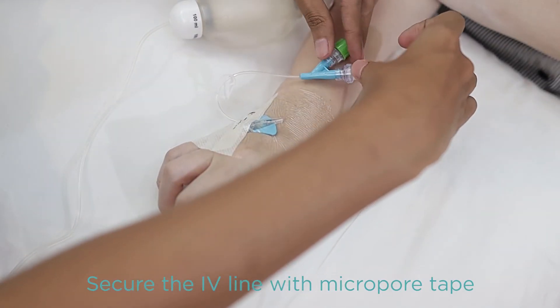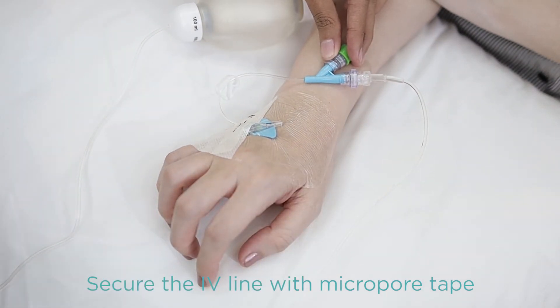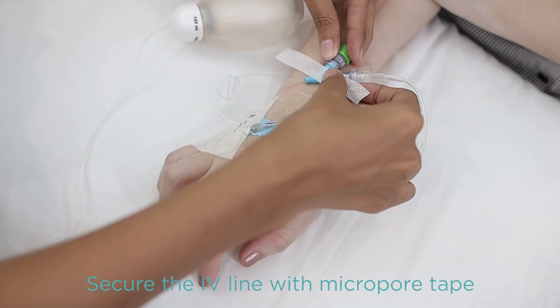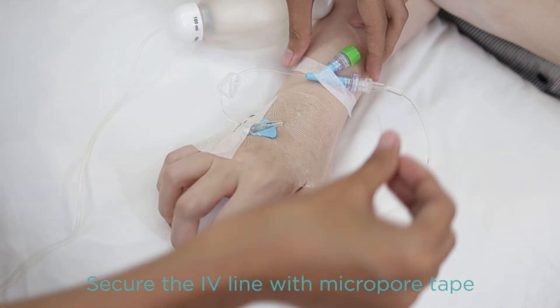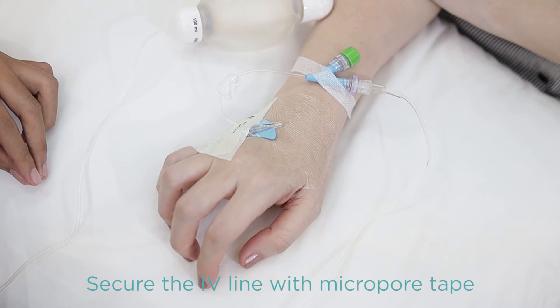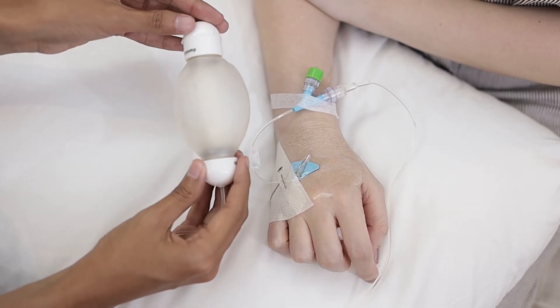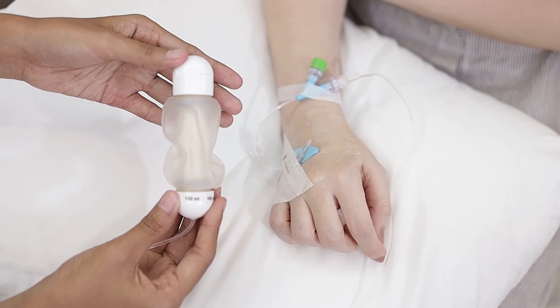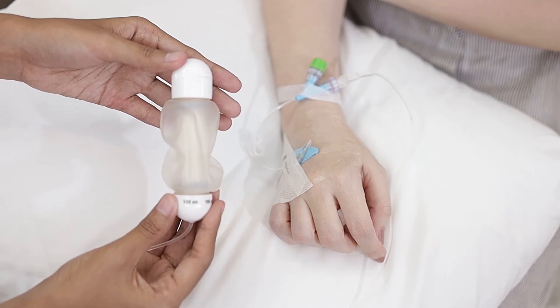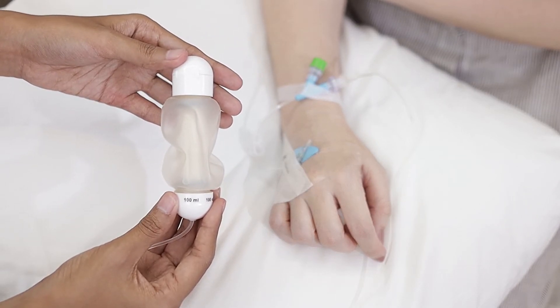At this point, the antibiotic infusion has already begun. Before you go about your daily routine, make sure the tubing is secured by taping the flow restrictor of the elastomeric pump to the skin. Do not tape the filter. The elastomeric balloon should gradually shrink in size during the infusion — this means that the pump is working properly.